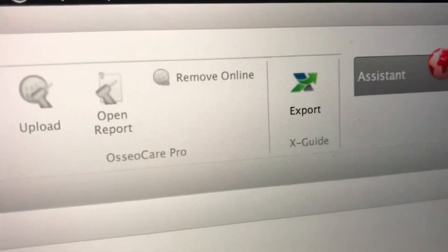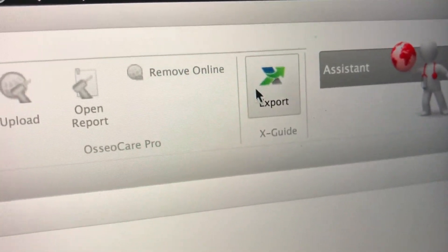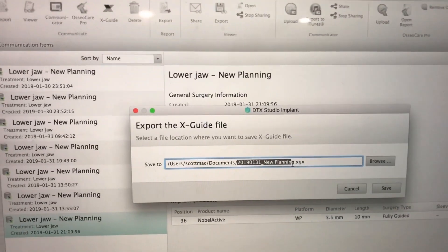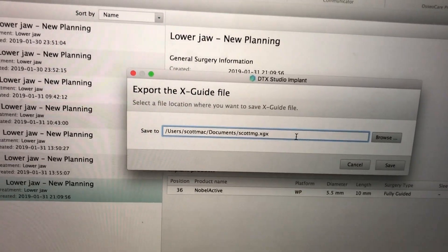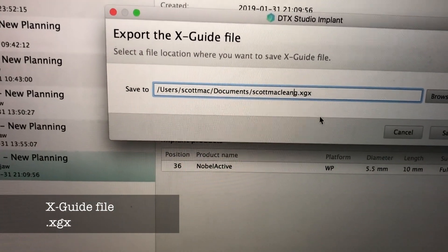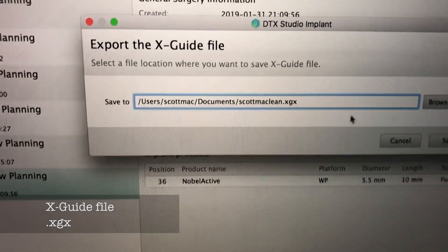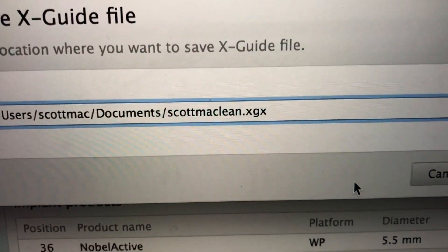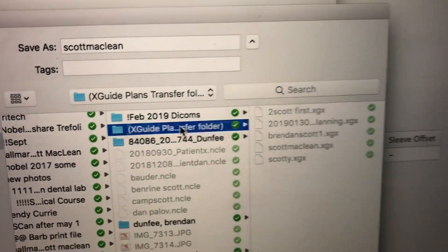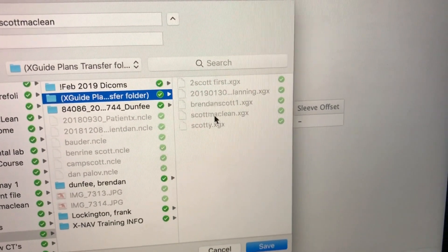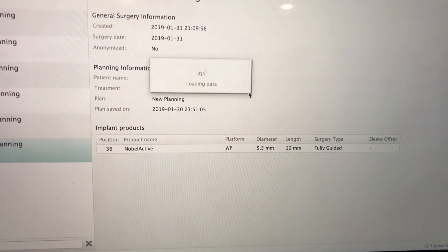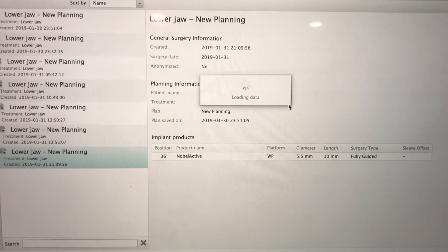You'll notice an export button. Because this file has now been created, we're going to export it over to the X-Guide. We'll click the export button and create a file name that has some meaning to us — in this case, I'm just going to put my name, Scott McLean, so it will say ScottMcLean.XGX, which is the X-Nav file we're going to use for navigation. We'll click save and this exports the X-Guide file. You're going to take this to a transfer folder, which brings you from your Windows or Mac environment into the Linux environment of the X-Guide. This is happening seamlessly between the three types of software systems.